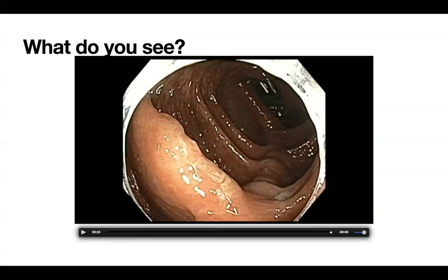So I tell them, let's take care of this polyp, and I bring you back at 6 months because I want to make sure that the scar is clean and there's no recurrence. At that time, I will examine the rest of the colon as if I'm examining for the first time. If there are polyps that we see, we will take care of them.